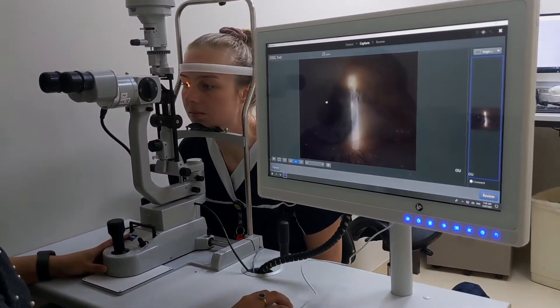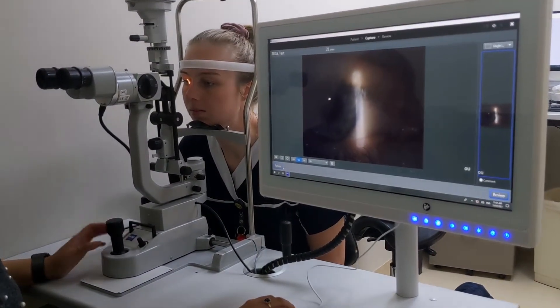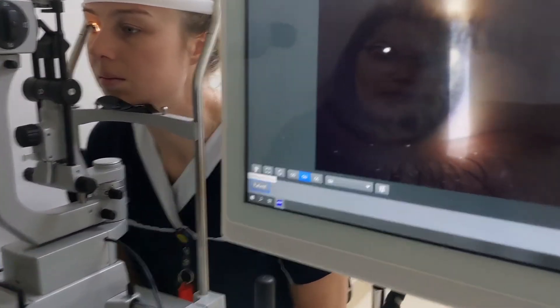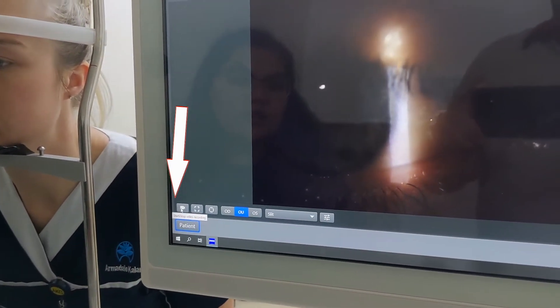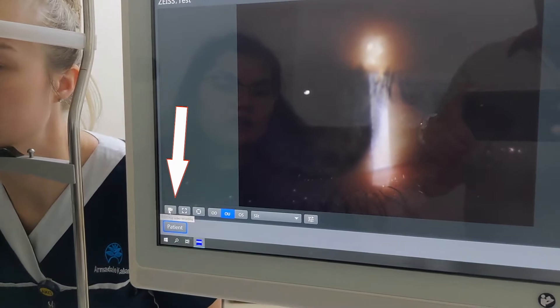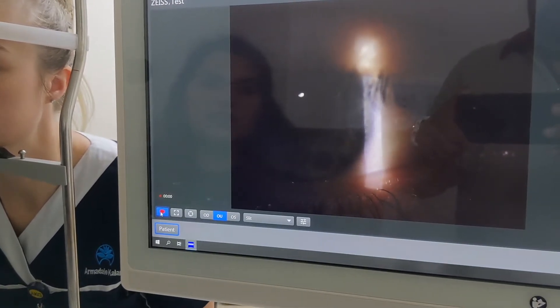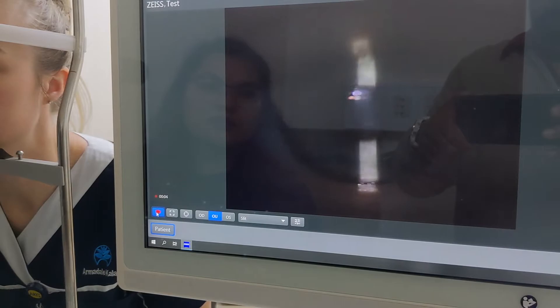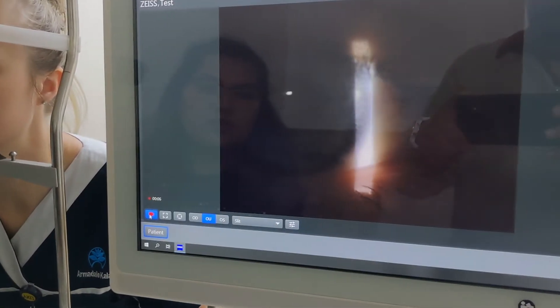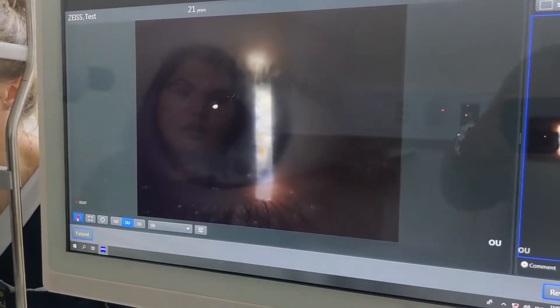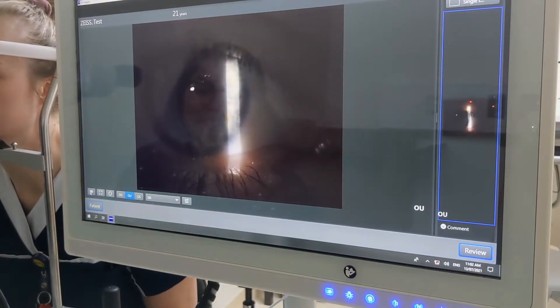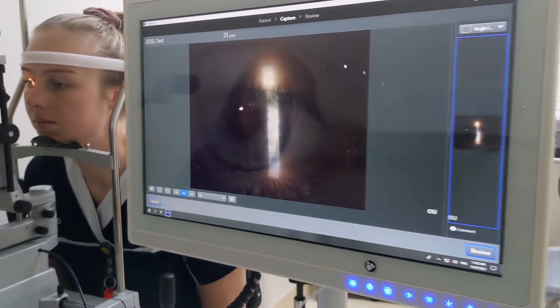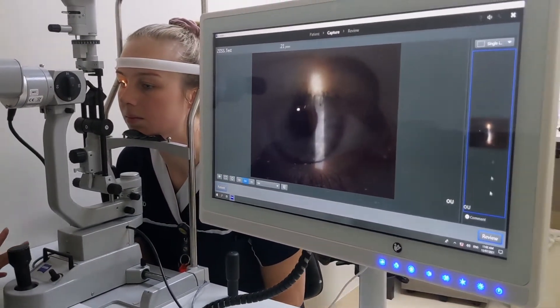You can also capture videos on the slit lamp using this button on the bottom left to start and stop recording. I'll start recording — Kelly, give me a few blinks, good. Press again to stop recording once you've captured what you need.